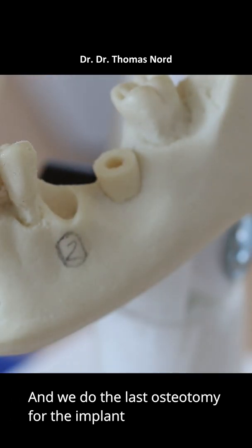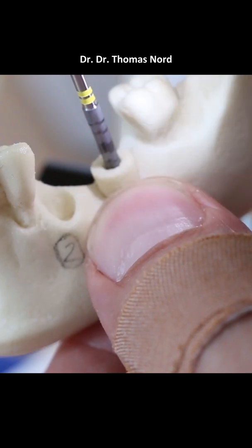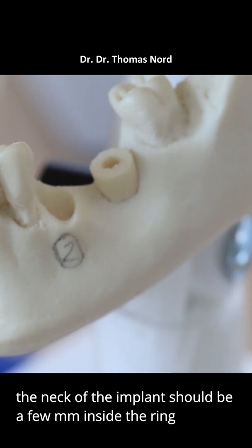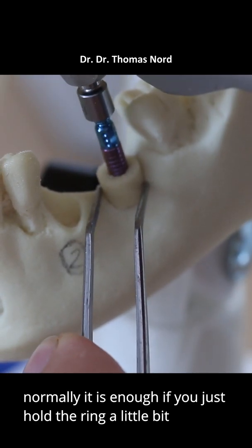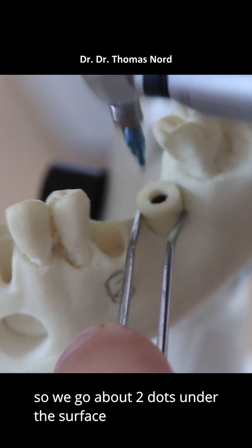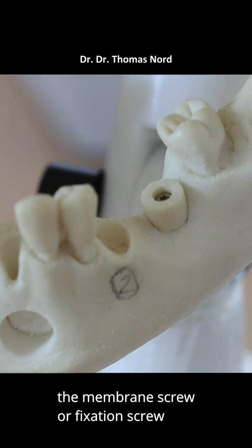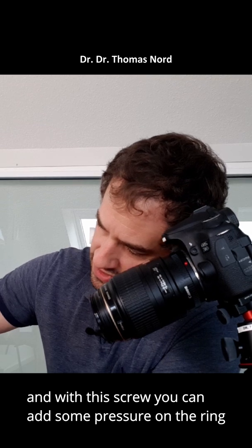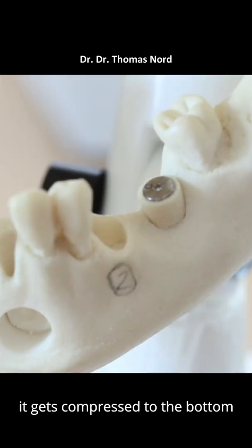And we do the last osteotomy for the implant. The neck of the implant should be a few millimeters inside the ring, about 2mm. Normally it's enough when you just hold the ring a little bit. We go about two dots on the surface. And if the ring has some mobility left, you can use a membrane screw or fixation screw — this little thing here. With this screw you can add some pressure on the ring, and it gets compressed to the bottom.